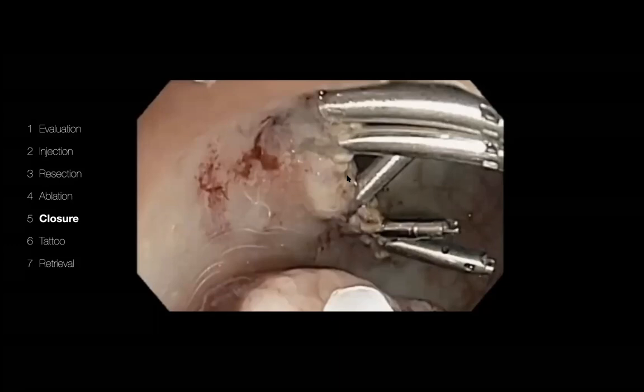It's just my observation: earlier in my career, I had a lot more bleeding, and now I have less bleeding by adjusting the settings. I don't use a 313 for every polyp. If I think there is a lot of meat to the polyp and maybe bigger vessels, I try to increase the interval. Also, I try to close a little bit slower for a large thick polyp. So something to keep in mind.